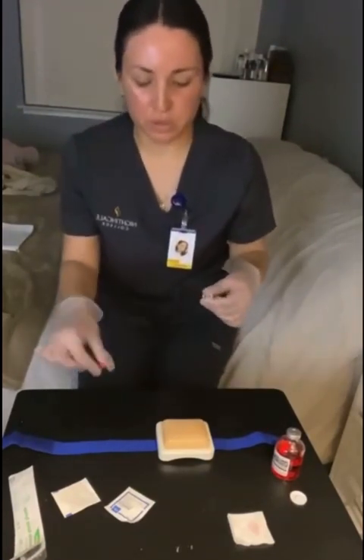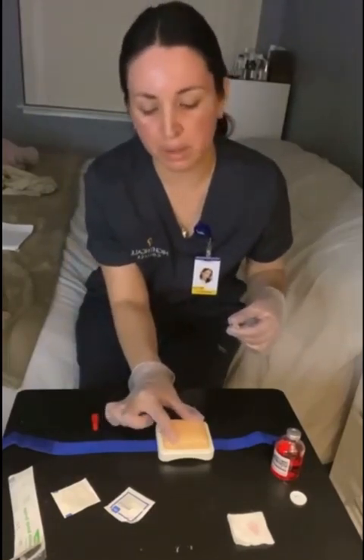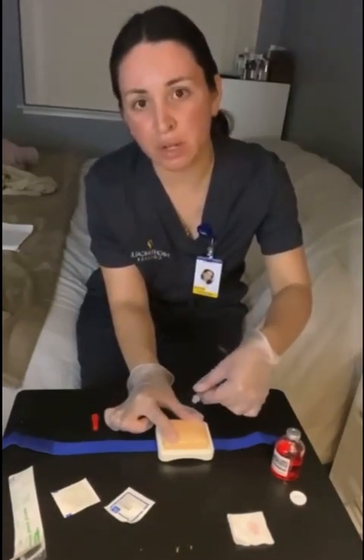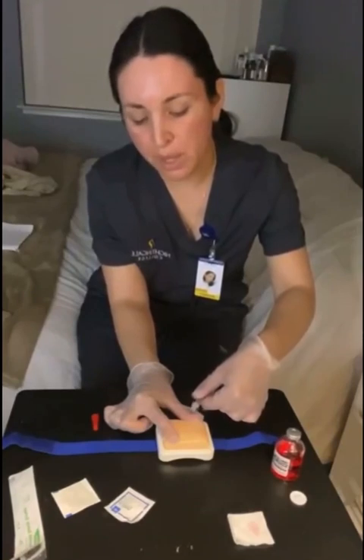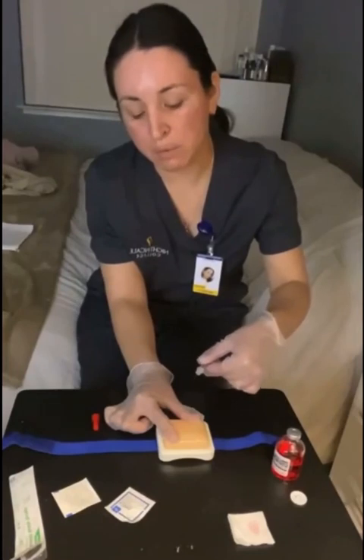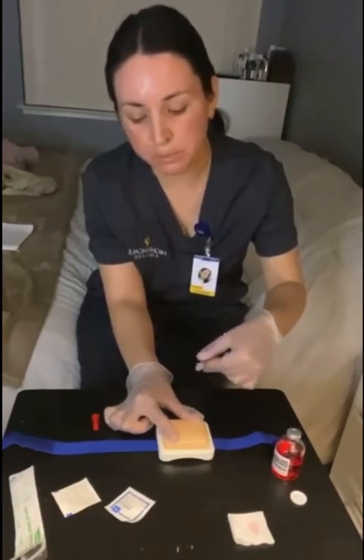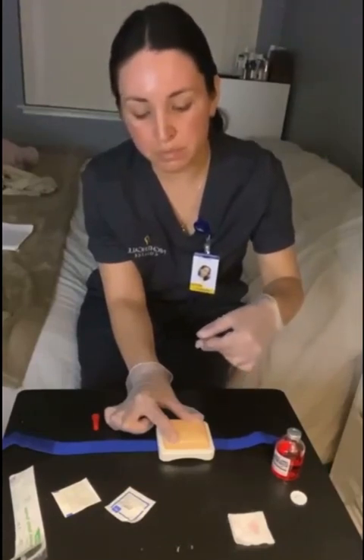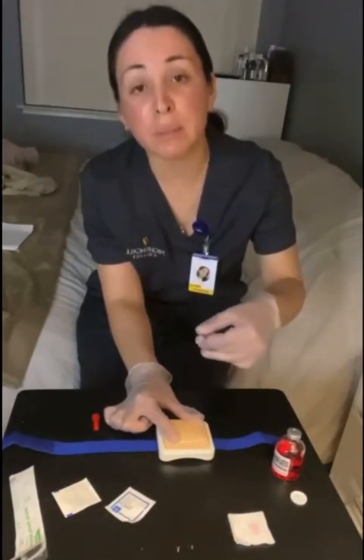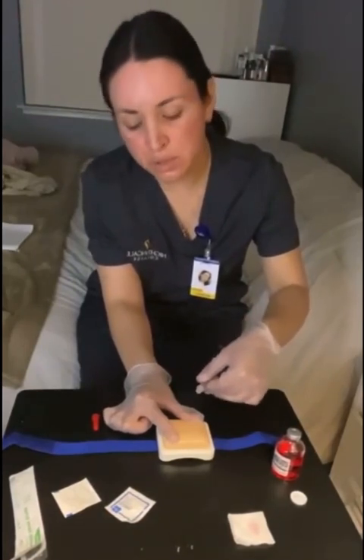I'm going to take my syringe and I want to hold the skin taut, pull gently back using my index finger and thumb, and I'm going to insert at a 5 to 15 degree angle with the needle bevel up. And before I insert, I want to comment that I would want to feel some resistance. If I don't feel any resistance, I would start over. The needle might be too deep. I also want to notice a wheal resembling a mosquito bite, anywhere from 6 to 10 millimeters.